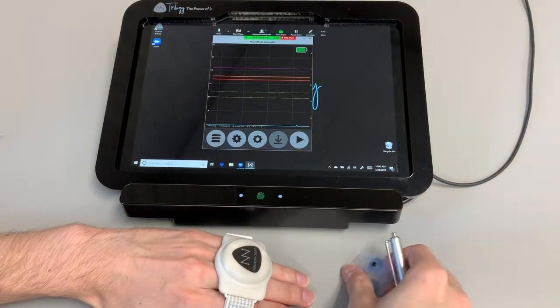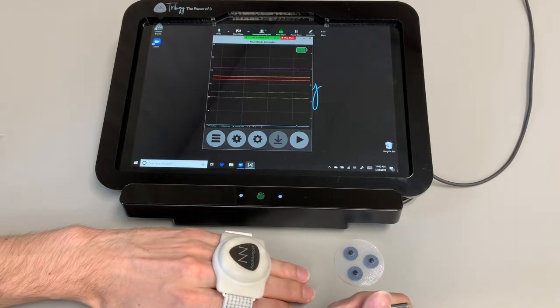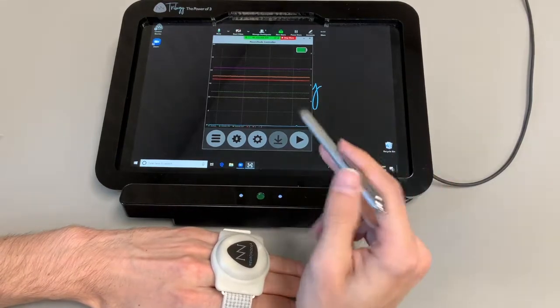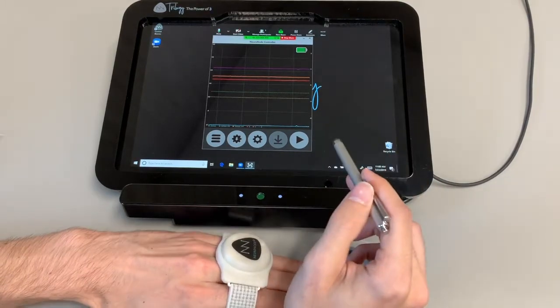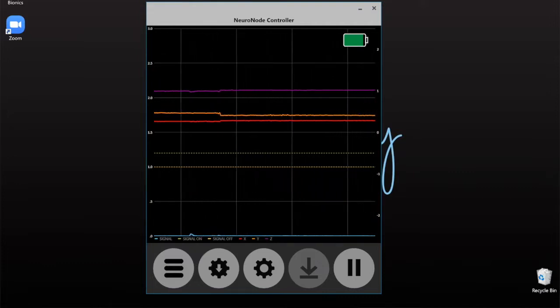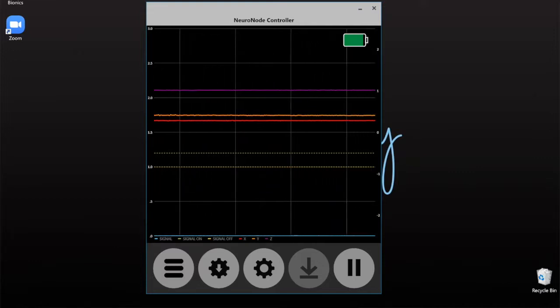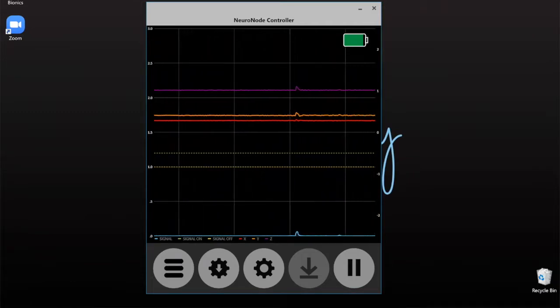So what you have here, as you can see, I've got my electrodes off, so I don't have this trying to read EMG off my fingers or anything. I just have this here just to have an easy place to kind of show where we've gotten the movement. There's going to be a lot on this graph screen, but we're going to go over it kind of step by step. I'm going to press play, take this out of pause, and you'll see that we still have our blue line for our activity, the green line for our activation, our yellow line which is for our rest. And then you'll notice three more lines up here.